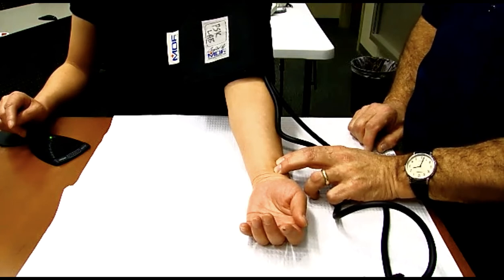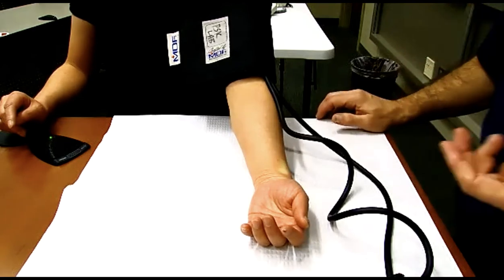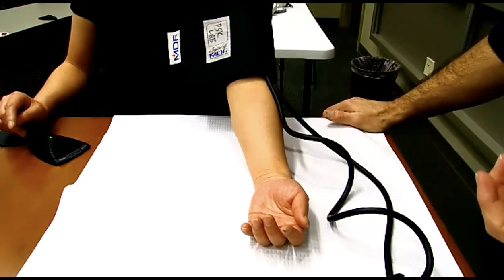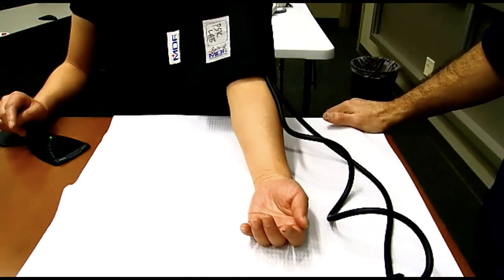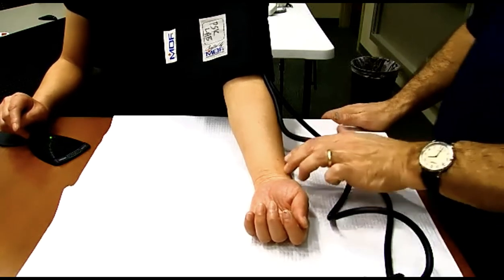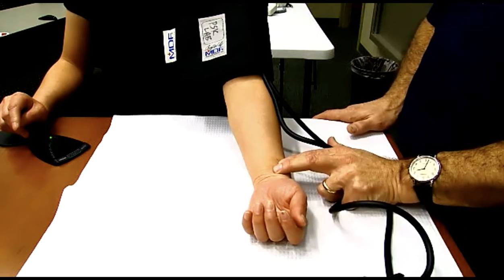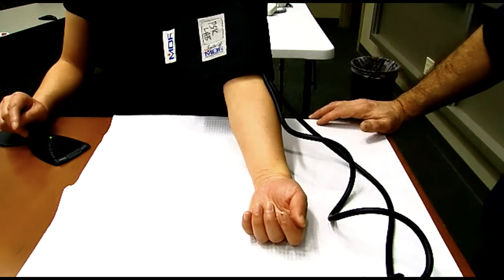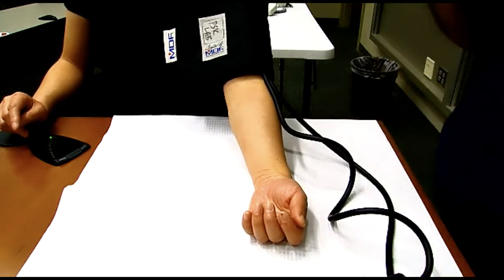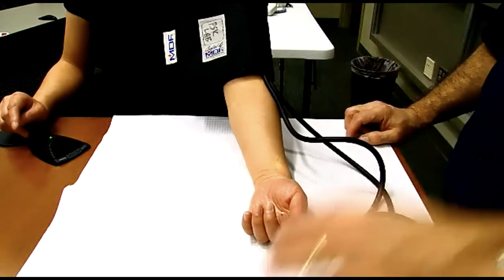You count the heartbeats. 1, 2, 3, 4. For 15 seconds. We want you to do it for at least 15 seconds. The value is reported in beats per minute. So you would take whatever number you get. If I measured 15 beats in 15 seconds, then I'm going to multiply that by 4 and say that her pulse rate is 60 beats per minute. If I do this and I count 20 beats in the 15 seconds, then her heart rate is going to be 80 beats per minute. So count for 15 seconds, multiply by 4 on the test. As soon as you're done doing that, you can take a piece of paper and write your answer down, so you don't have to memorize it.